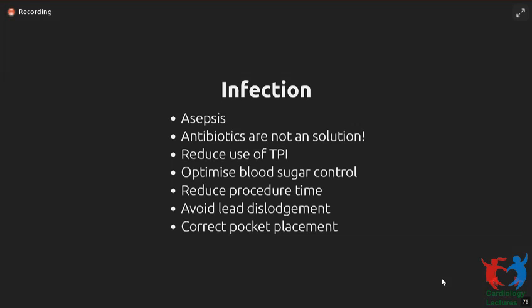Usual, I think an experienced center, a single chamber device should take about 30 minutes, a dual chamber device should take about 45 minutes. So let's say up to about double this is acceptable. But if you're taking more than 1.5 hours to do a dual chamber device, you should probably review your practices to see if there are issues.